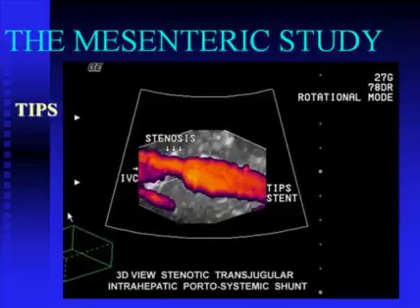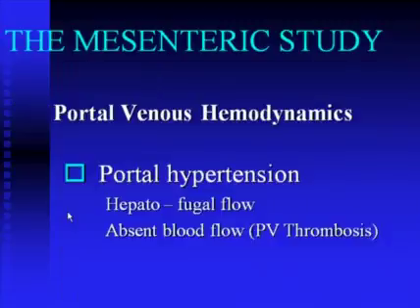You can even get into three-dimensional reconstruction in today's duplex ultrasound systems, which show that whole system very clearly: the stent, the stenosis, and the inferior vena cava.